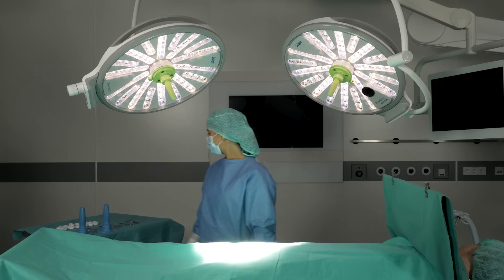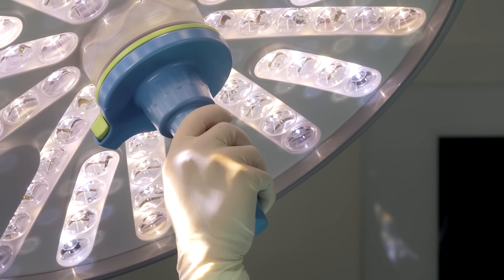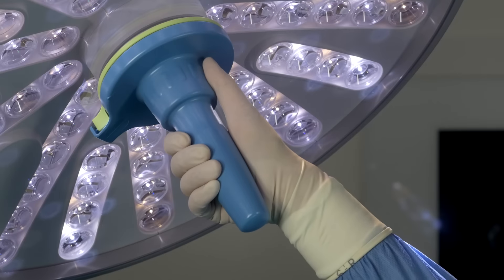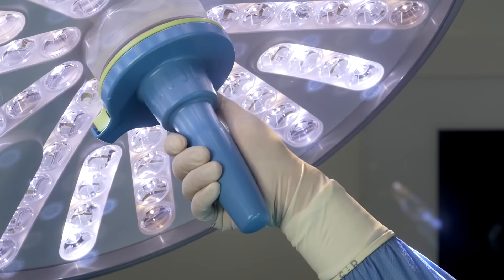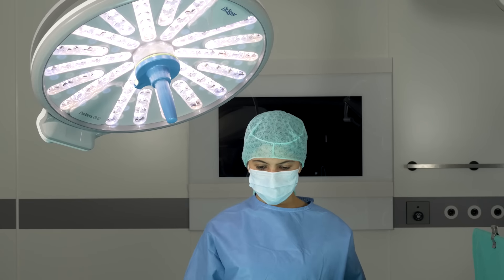Sterile staff can position the Polaris quite easily with one hand using the central hand grip and then adjust the size and diameter of the light field. The hand grip works with touch technology and was deliberately detached from the camera to enhance the ergonomics in every use.